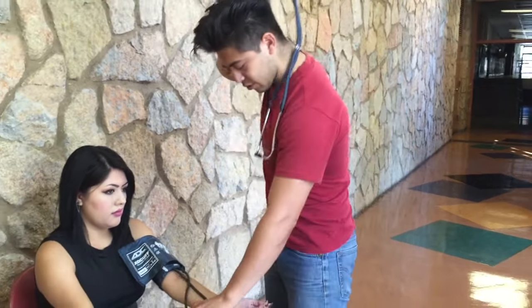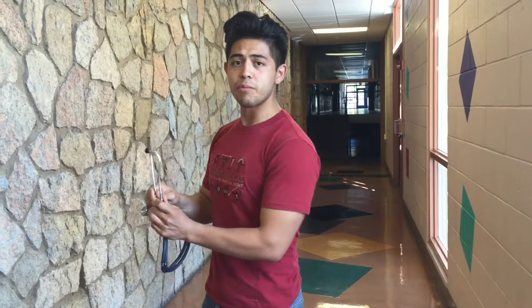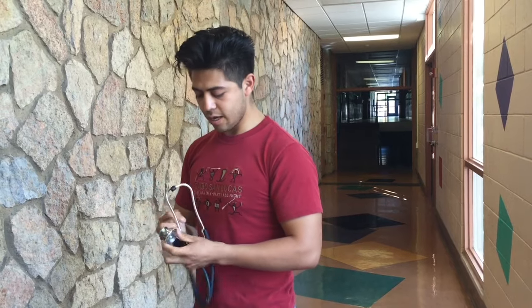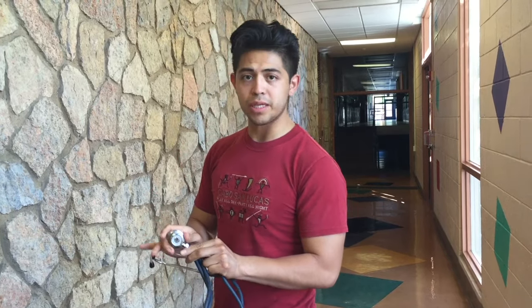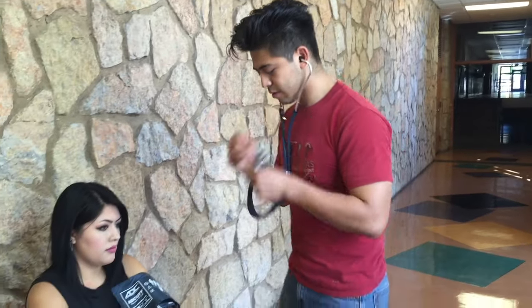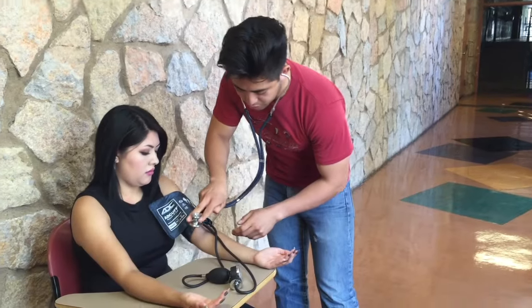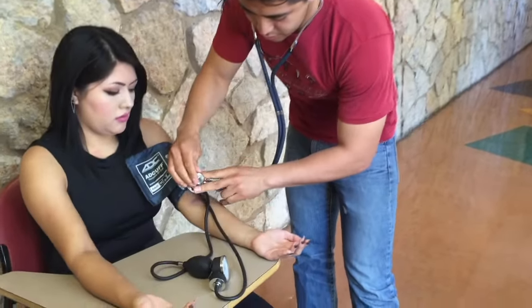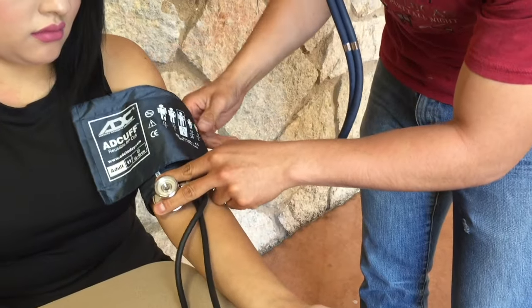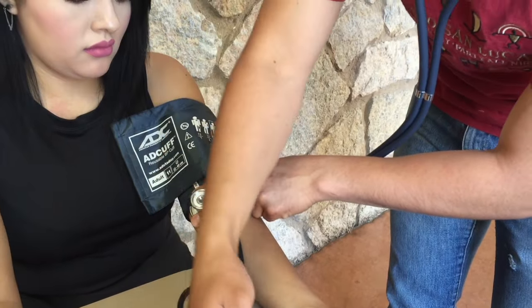When you use your stethoscope, you want to make sure that the prongs are facing away from you to ensure proper hearing and to assure that the diaphragm is completely tight. When you place the diaphragm on the arm, you want to make sure that you use your non-dominant arm, placing it with your index and middle finger on each side.